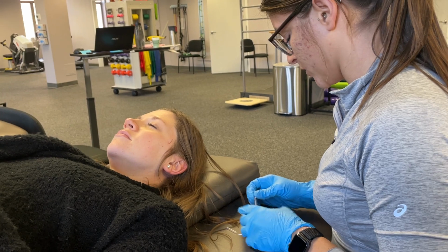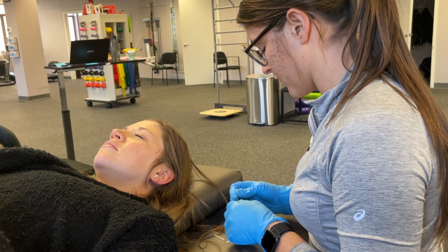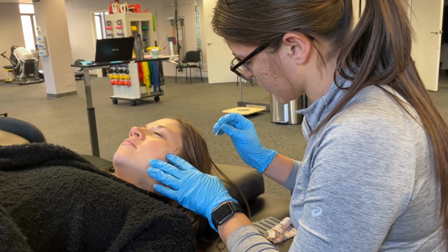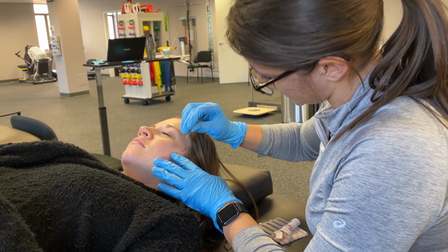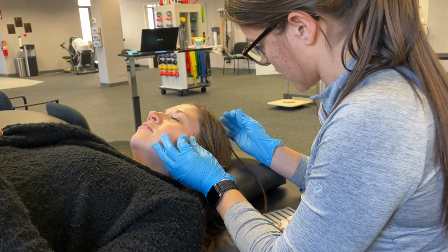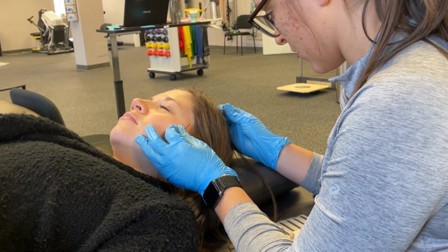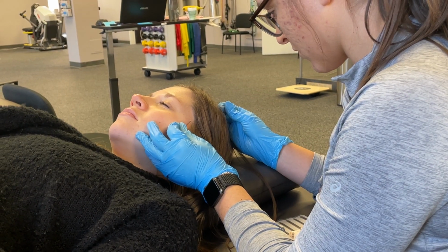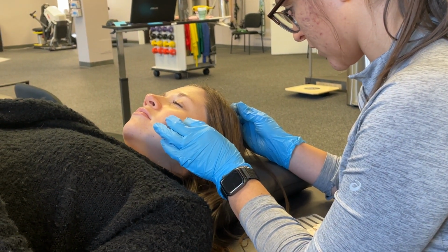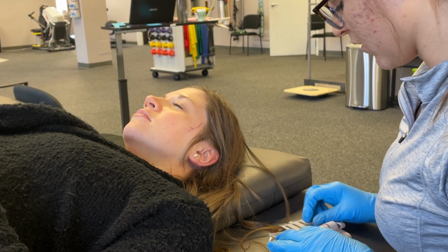All right, next we're gonna go just inferior to the first placement, and we'll be targeting the tensor or levator veli palatini, which also has an attachment into your auditory canal, resulting in some ear pain or tinnitus with associated jaw pain.